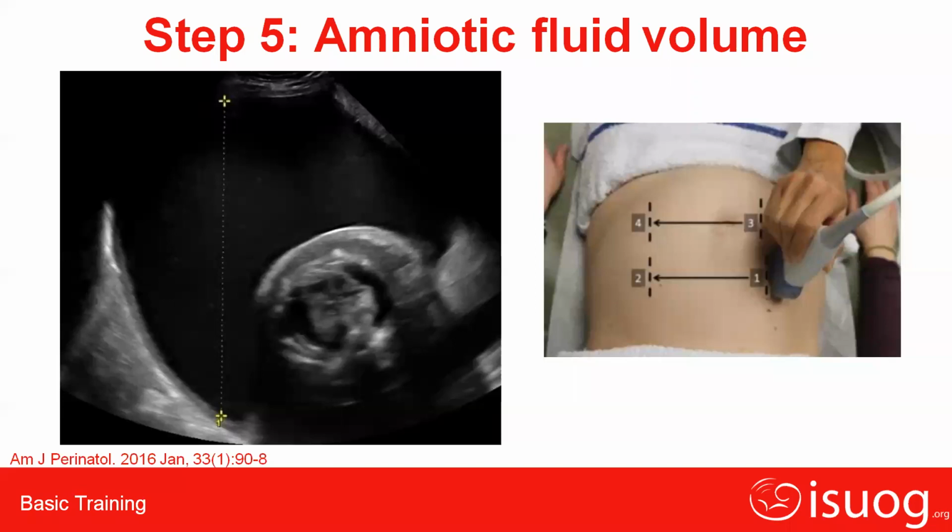Disturb fetal. Studies have shown the AFI was 4.35 centimeters higher for a fetus lying centrally within the uterus compared to a fetus lying laterally in the uterus. So in these cases, you have to do single deepest vertical pocket.